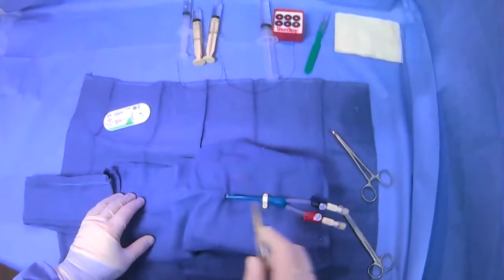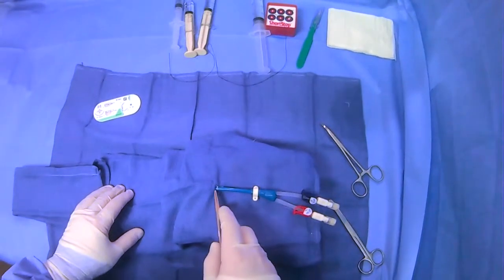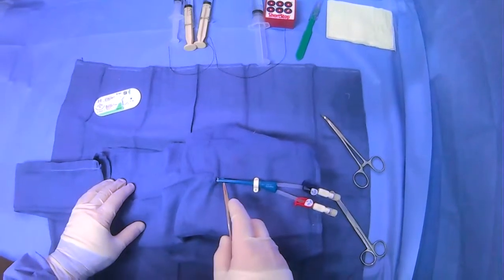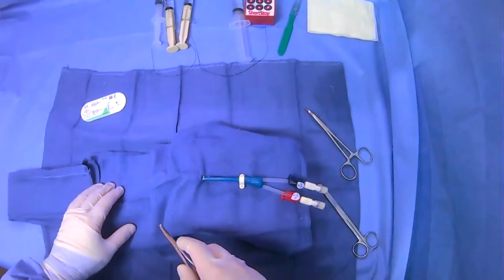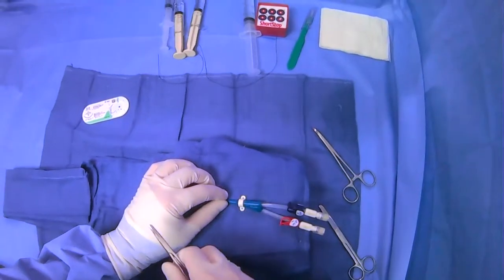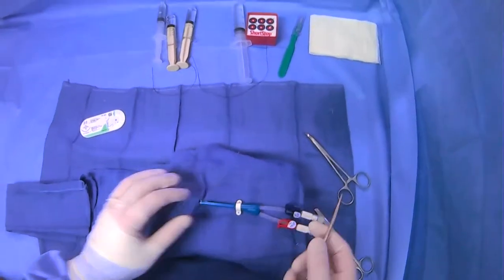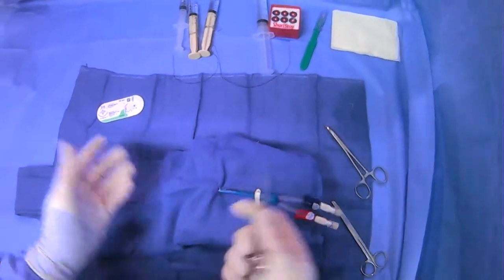As we've discussed, there are multiple ways to secure things like a dialysis line into place. You can suture around the tunnel site, which I showed in a prior video, but also there's a way to use the manufacturer-provided areas to suture and secure the catheter in place. This can be done in addition to suturing here, or instead.